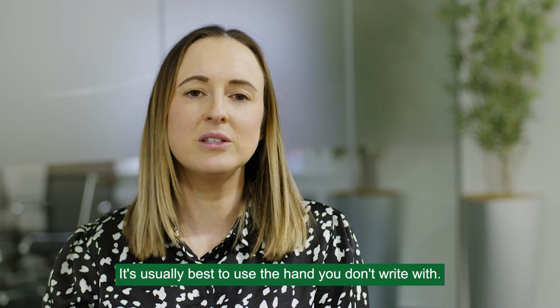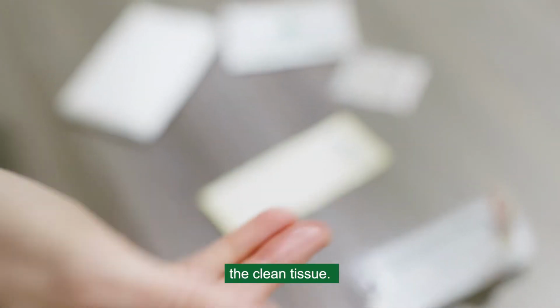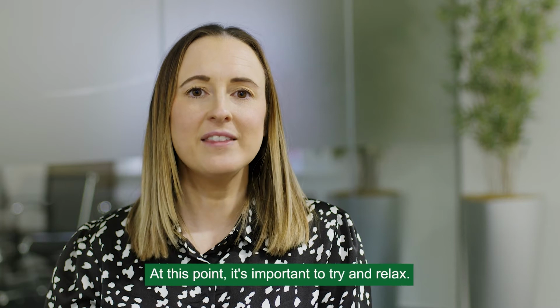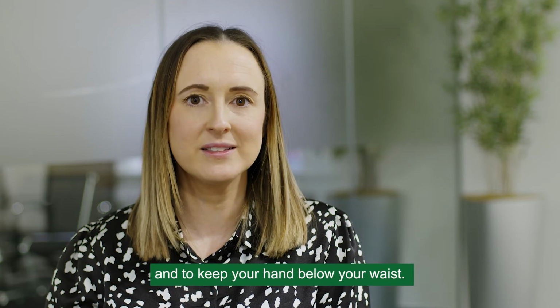It's usually best to use the hand you don't write with. Use the Alco-Tip wipe on the chosen finger and then wipe dry with a clean tissue. Ensure your finger is completely dry. At this point, it's important to try and relax. We recommend doing the test standing up and to keep your hand below your waist.